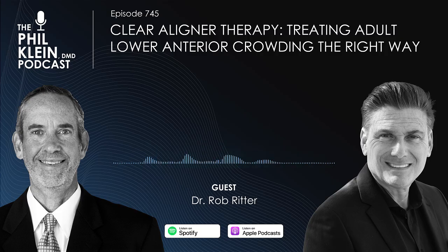And I think the patient understands just by looking at the scan that a lot of times, because we need to make some major changes to accommodate the space and the size of the teeth, we're going to have to go and strip some of those teeth out a little bit. And of course, I don't say stripping or cutting. I say we're just going to remove a couple of hair thickness of the enamel. You have 1,000,000 years worth of enamel. And you're looking at what? 0.2 millimeters, 0.3 millimeters? Most of the time, and that's probably the max.